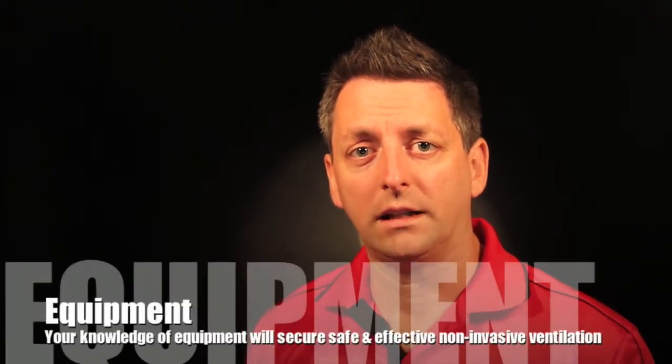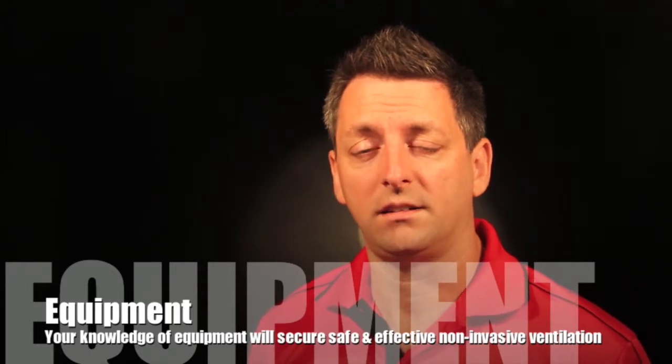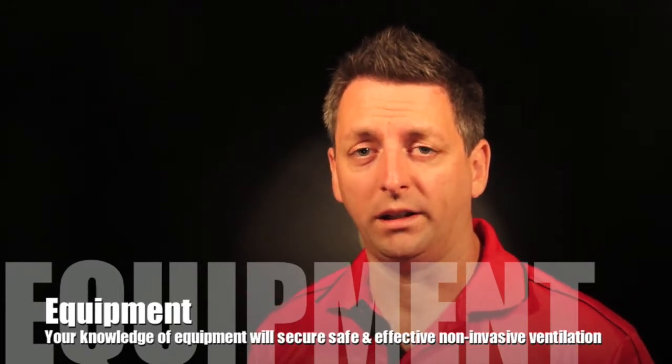Other things to assess is the type of non-invasive ventilator you're going to use. Does it produce high flow air? So even if you do have a big leak, it will still be powerful enough to give you the pressures you require to adequately ventilate a patient. So now we've assessed that this patient can go on non-invasive ventilation.